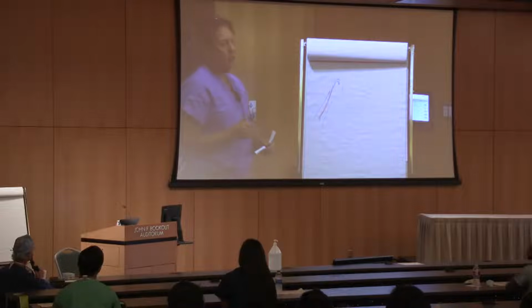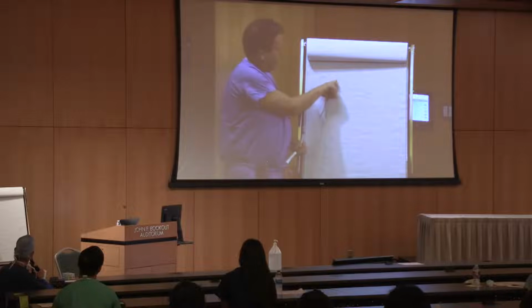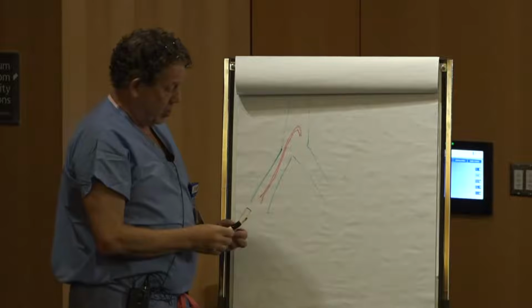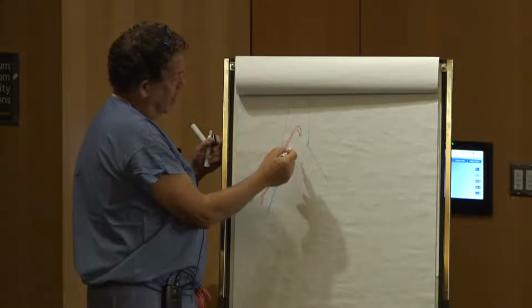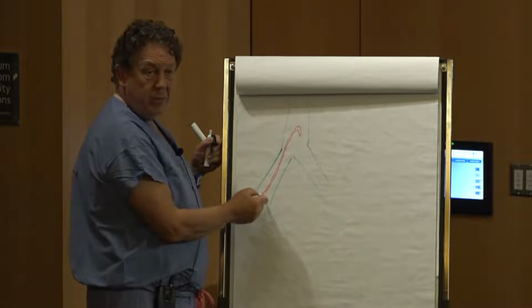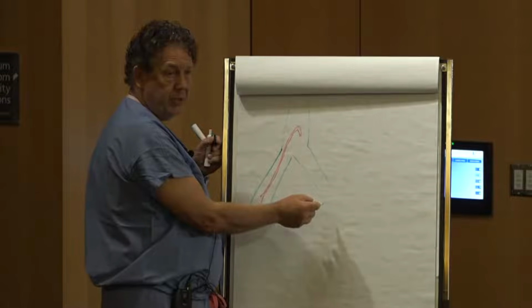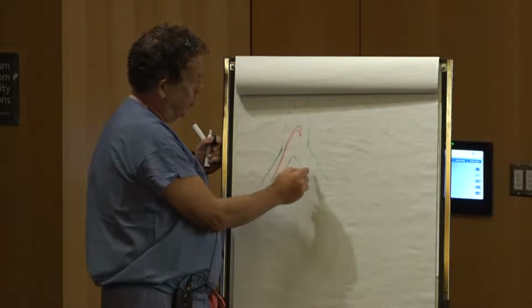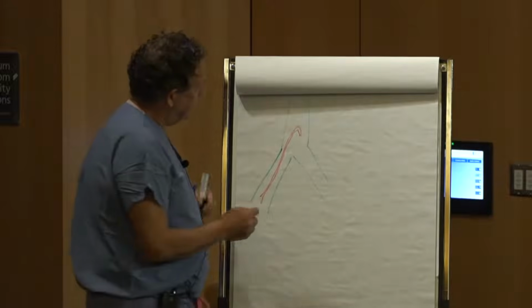The Sos Omni will. It's got a much tighter curve. So you pull the wire back, and the catheter will automatically do that. And then you're coming through this with the wire, and you're kind of pointing the wire down here. Sometimes the wire will go back down the same side as you went up. Sometimes it goes down the opposite side. Sometimes it kind of wraps around this and goes down the opposite side. Then you've got to figure out how you unwrap it.